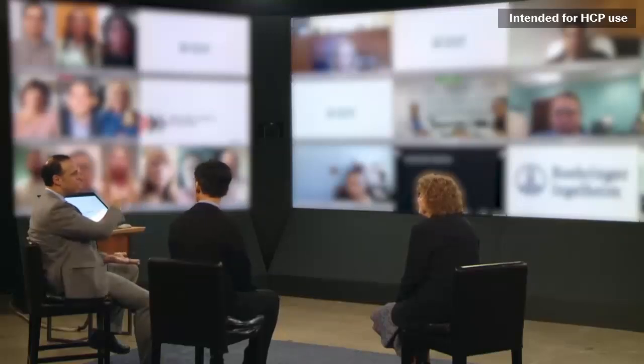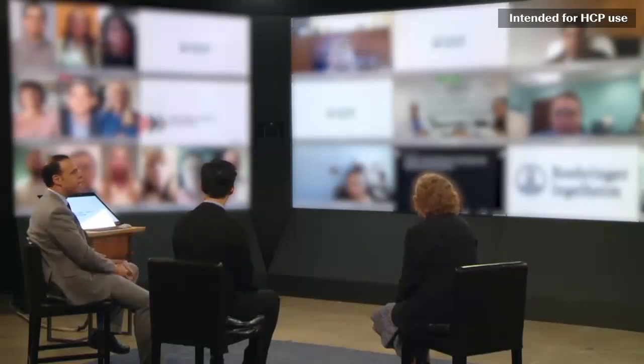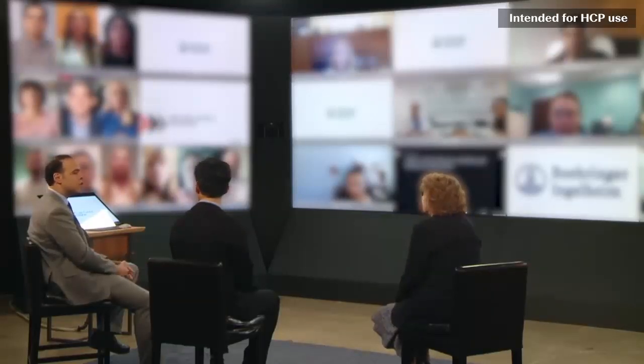That's a great question, and I think many of these patients, we will also sometimes do prone imaging for these patients, as you know, in order to look at the back part of their lung when it's up against the sky, as opposed to being dependent and suffering from atelectasis potentially. And a lot of these patients don't like to handle that. So we always do it for the first scan. And then the subsequent scans will depend on what that initial diagnosis was. And if we are confident that, hey, this first CT scan didn't show anything at the back of the lungs that we're worried about, didn't show any signs of air trapping, then we'd be confident following that patient with, say, UIP or NSIP with just an inspiratory HRCT, particularly if the patient can't tolerate it.